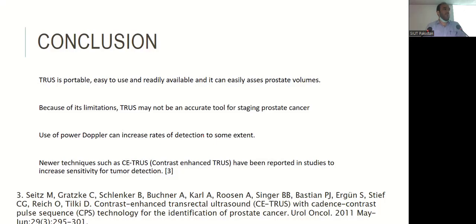If your needle is going towards the 5 o'clock position for the biopsy and you think you might hit a vessel, an intelligent ultrasonologist can always have this information by just putting a finger on the Doppler, to see whether vessels are there or not. So there are many things that can be explored. It's not only isoechoic or hypoechoic regions that can be seen through TRUS. It's a tool, and it can be used intelligently.